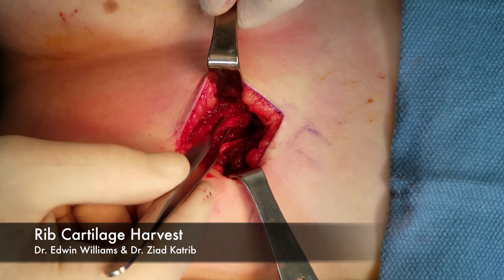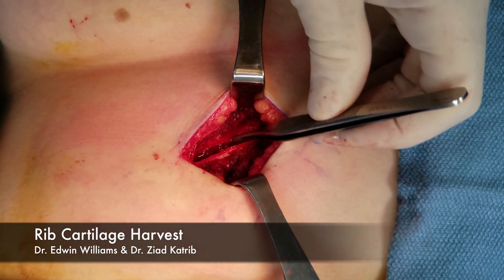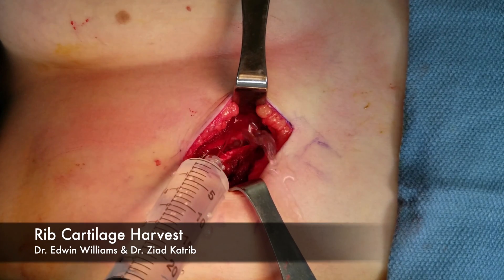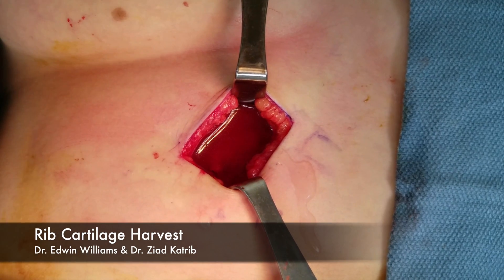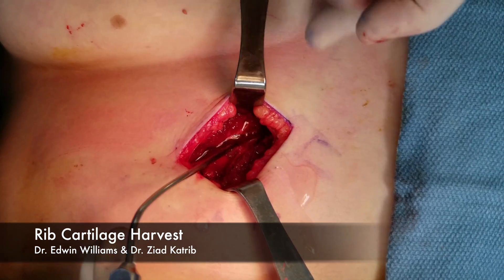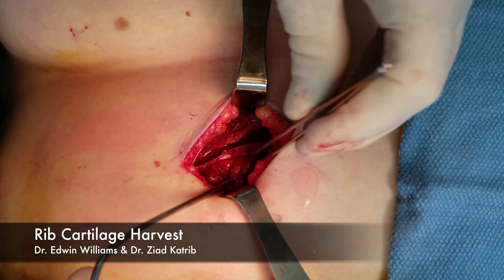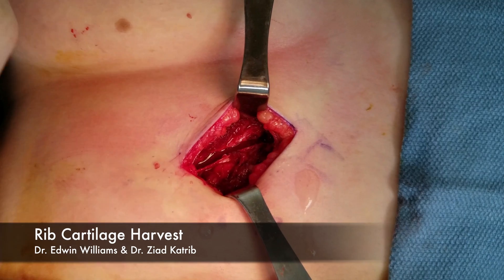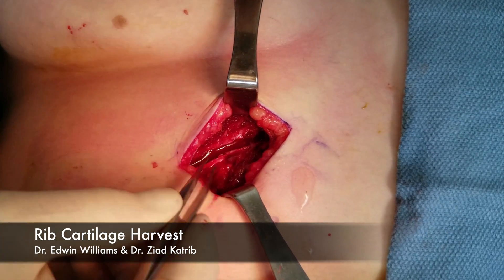When we close here, first thing we do is put some saline. Scott, would you give some positive pressure? Here's the periosteum right here. By leaving the periosteum, not only is it more comfortable for the patient, but we've got positive pressure here — we're not blowing bubbles. So we know we're not through into the pleural cavity. We'll also close this layer here, then close — here's the rectus. Eliminate the dead space and then close the skin. We've got our rib out. There's another little floating rib down here — if you need another little piece, you could always come after this one as well.